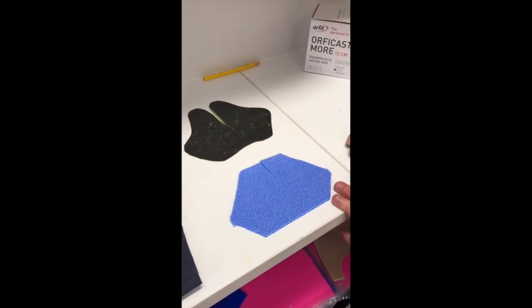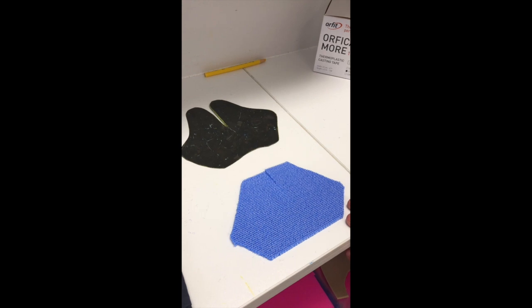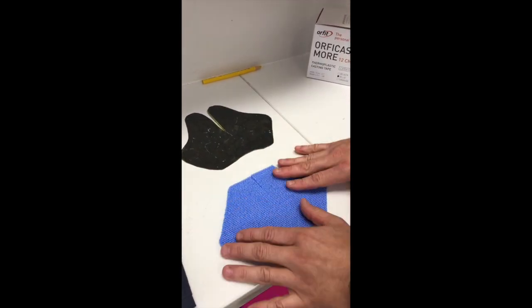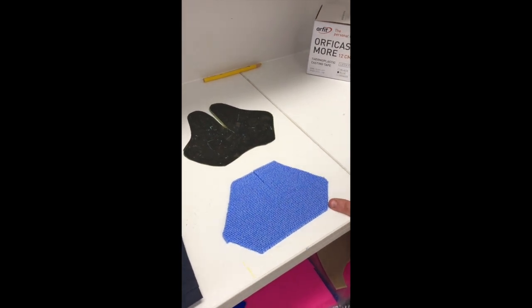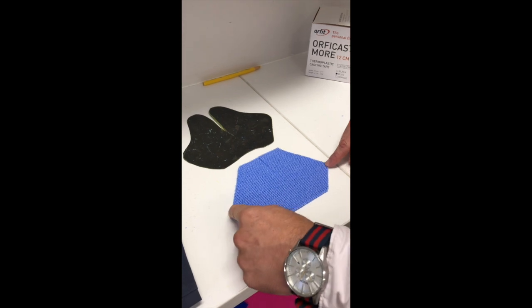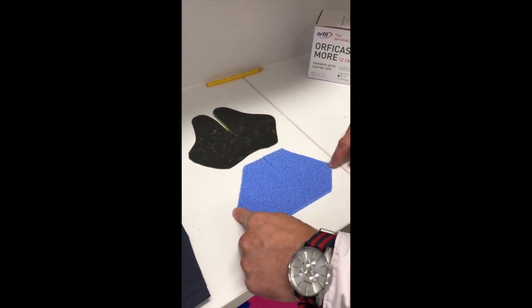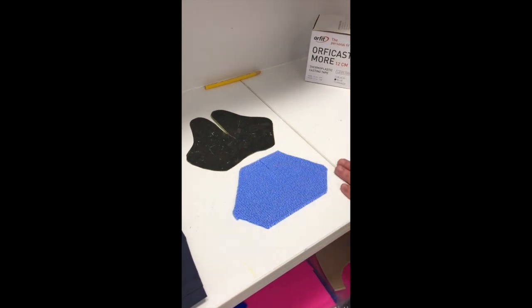Here we can see our traditional butterfly pattern. You can see that there's actually no need to trace that perfectly onto our Orphicast More, although you can if you like. We've got a similar length to our thermoplastic but not quite as much width, which is fine. This product is quite stretchy.